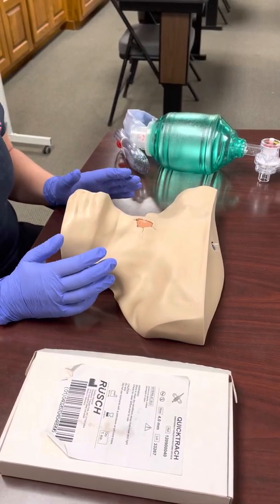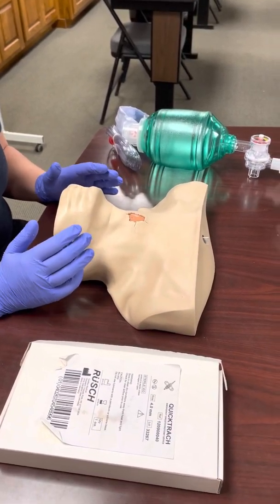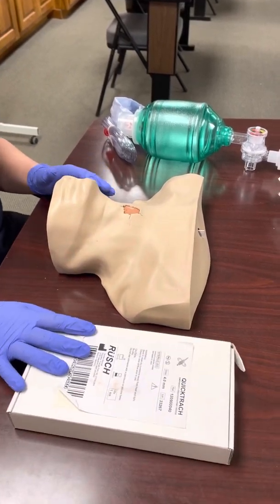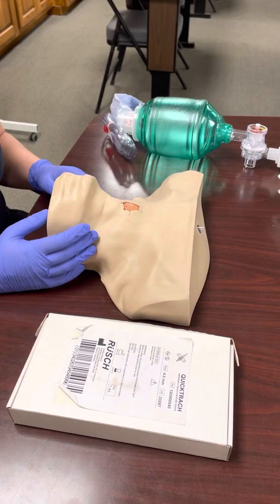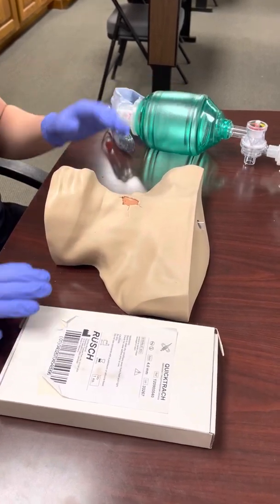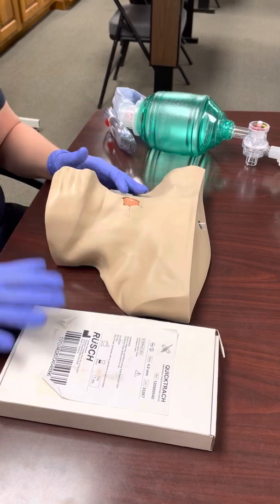In this video I'm going to demonstrate the Quick Trach, which is the crike kit that we carry where I work. It's a pretty popular crike kit. The only supplies you need are the pre-packaged Quick Trach kit and a BVM.